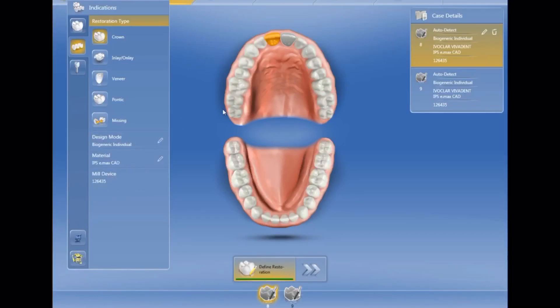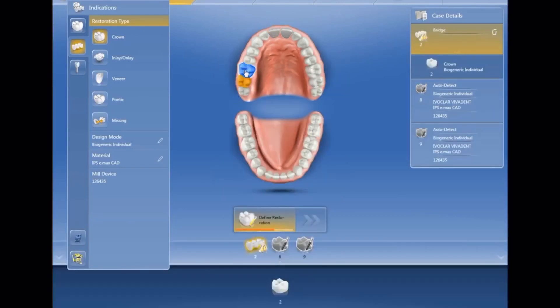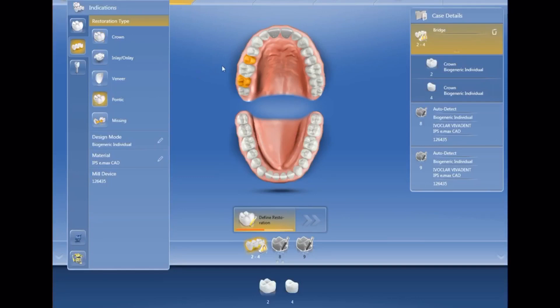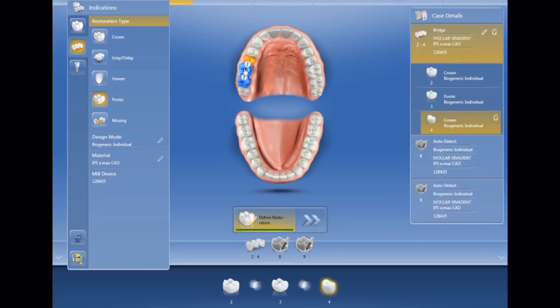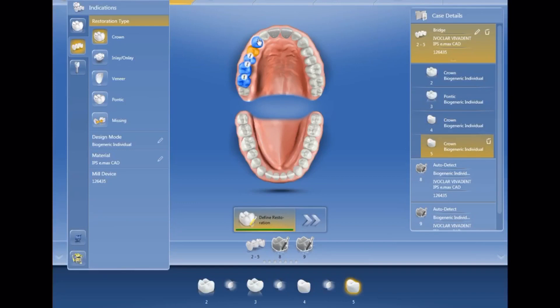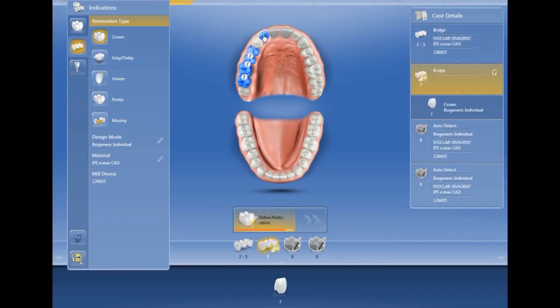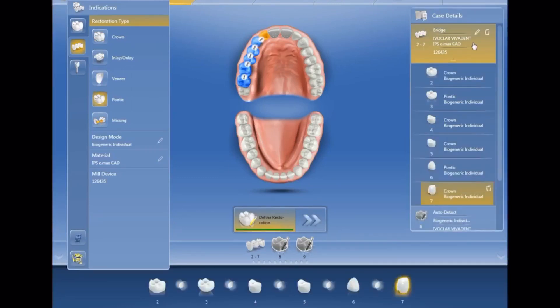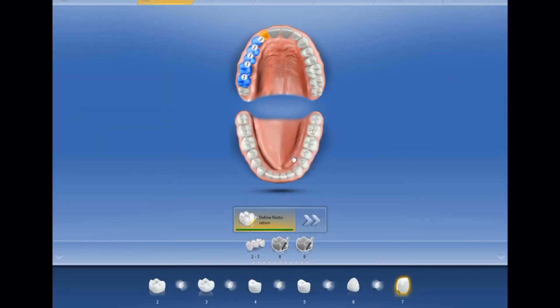I'm going to select the abutments on two and four, then move to the pontic. Mind you, I had never done two adjacent bridges concurrently with a CEREC before. I set up the two abutments on the adjacent bridge, then moved to the pontic — and you'll notice the image is showing one giant bridge with two pier abutments in the middle, which is not what I wanted.